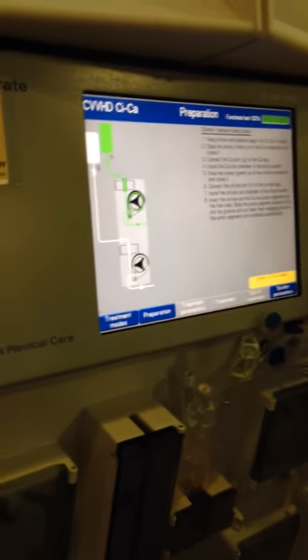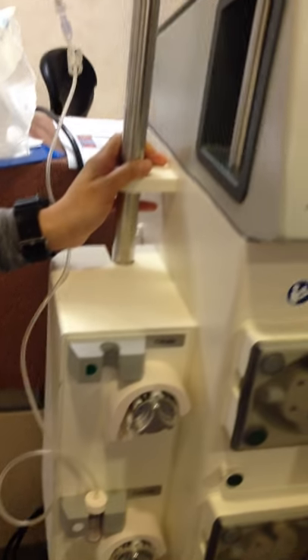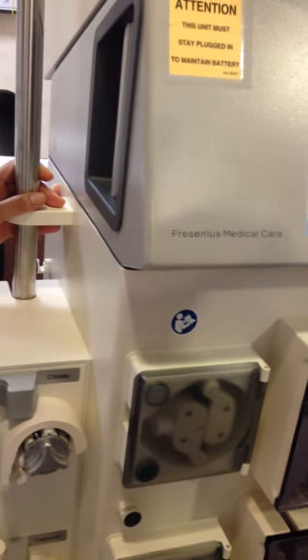Slide the green clamp up to the citrate connection and close it. Okay, slide the clamp now. This one again, make sure you clamp it. Very important. This is a very important clamp. You won't miss it because this is a screw thingy, it's not a spike.